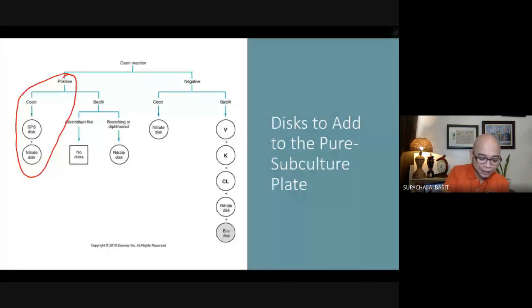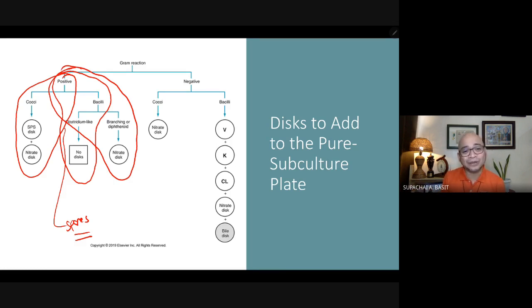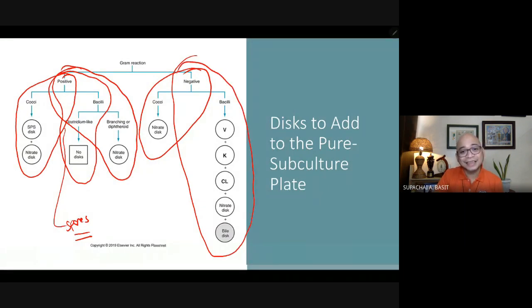If we are dealing with gram-positive bacilli that appear like Clostridium, perhaps because of the presence of spores, then we don't use any of these at all. But if we are dealing with gram-positive bacilli that are branching or diphtheroid-like, then we use the nitrate disk. If we are dealing with gram-negative cocci, we can use the nitrate disk. And if we are dealing with gram-negative bacilli, okay?